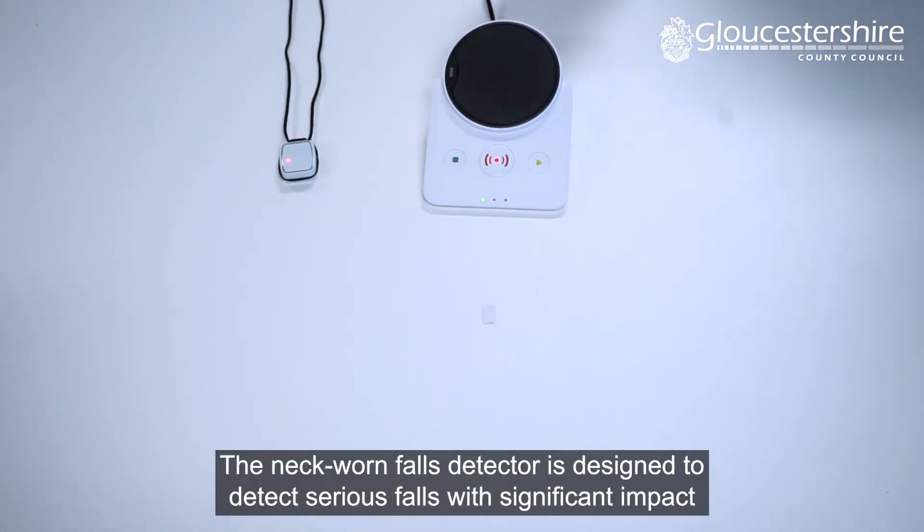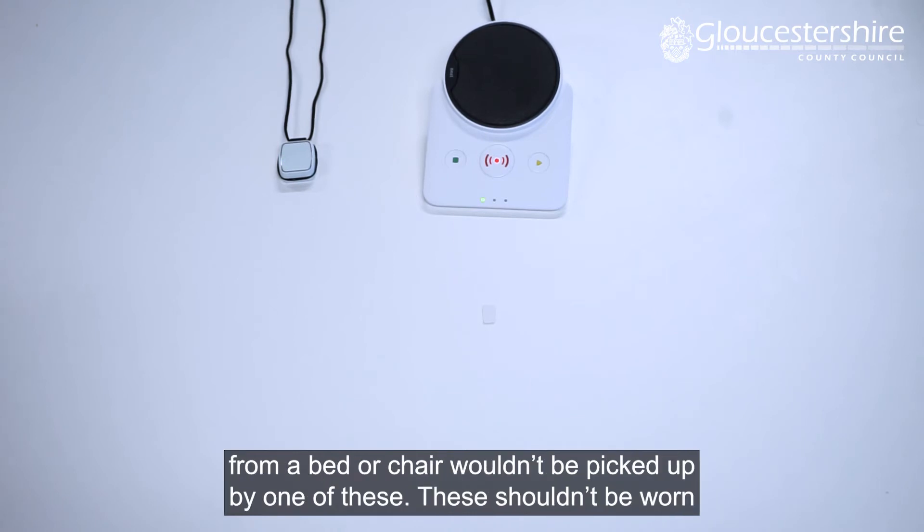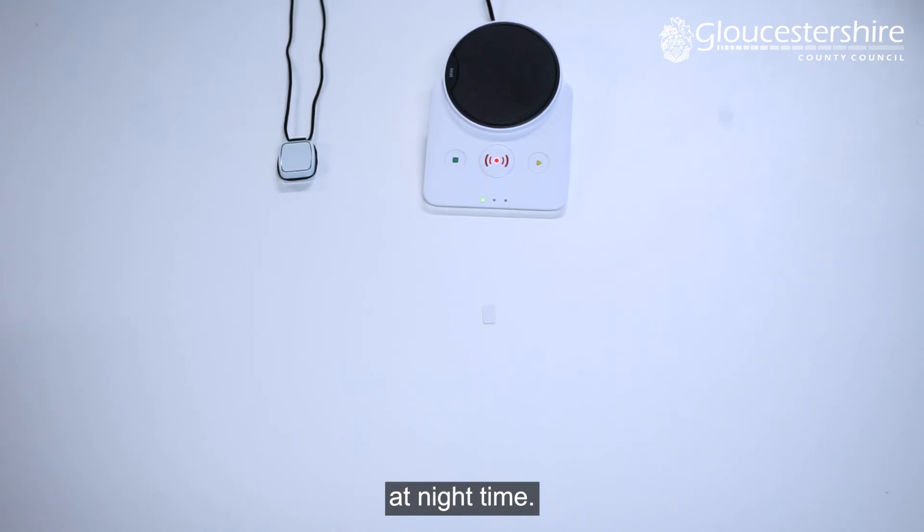The neck-worn fall detector is designed to detect serious falls with significant impact that happen from a standing position. It is important to note that any gradual falls from a bed or chair wouldn't be picked up by one of these. These shouldn't be worn at night time.